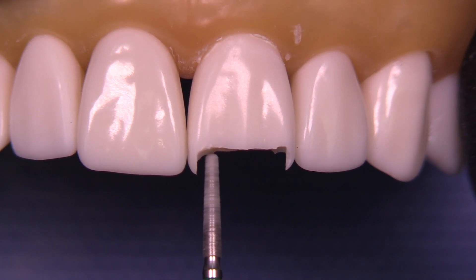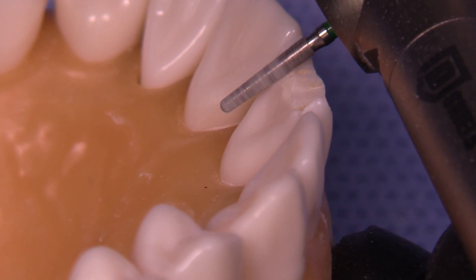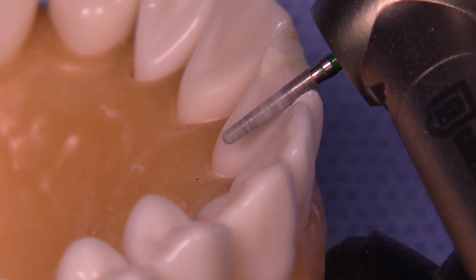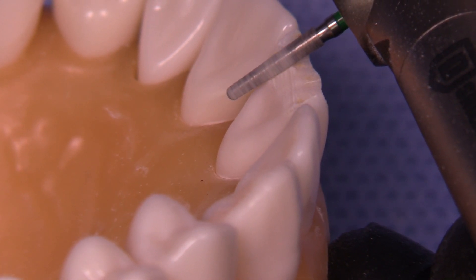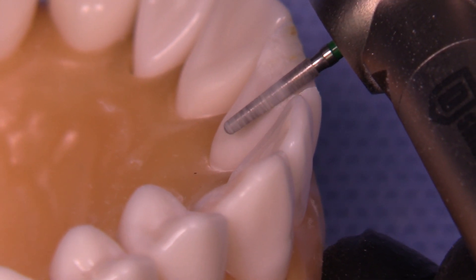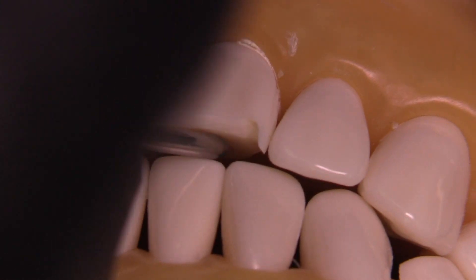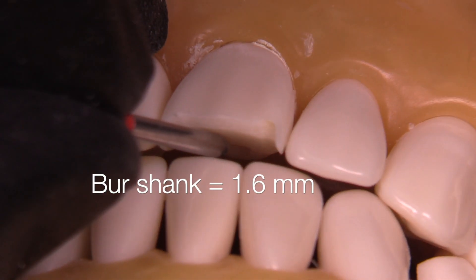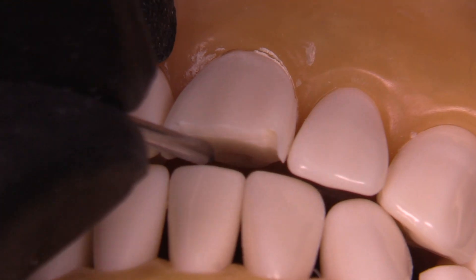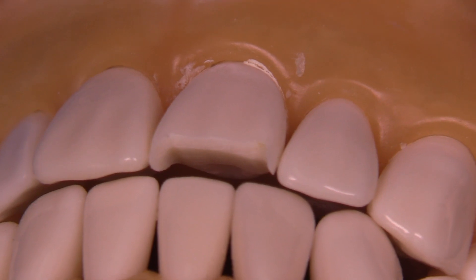Leave a little flange on the end because we're going to remove that in a further step. Step two is lingual clearance and we're going to use the same burr — it's still in the handpiece. We're trying to get 1.5 millimeters of lingual clearance when we look up at the tooth at about a 30 or 40 degree angle. If you don't have an instrument to measure with, you can use the shank of a burr, which is 1.6 millimeters — it's a pretty cool trick.